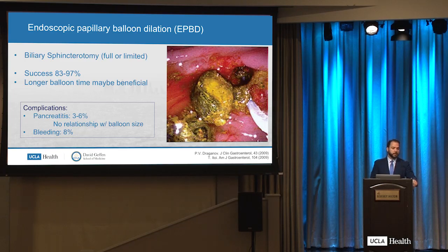So usually it's successful, and we will talk about some challenges. Sphincterotomy can be complete or partial, and complications include pancreatitis and bleeding. It has been looked at, and the size of the balloon does not correlate with the risk of pancreatitis.